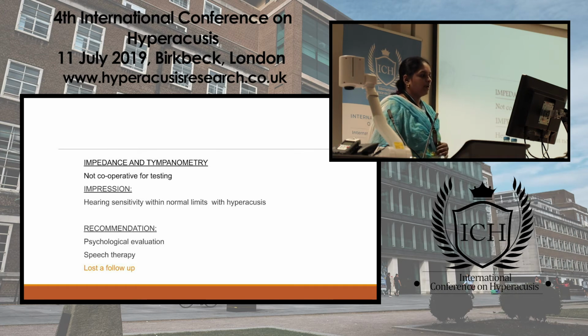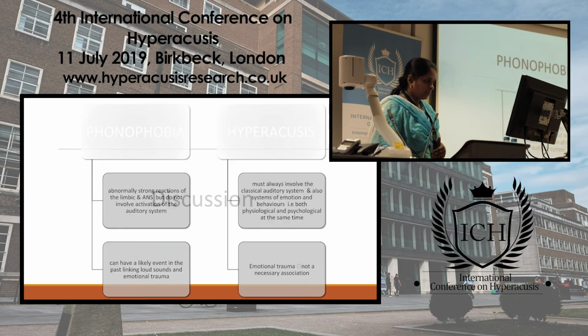But we couldn't do impedance audiometry and tympanometry, and with that we gave an impression of hearing sensitivity within normal limits with hyperacusis. The recommendation was that evaluation by other teams be done. And moving on to the discussion.